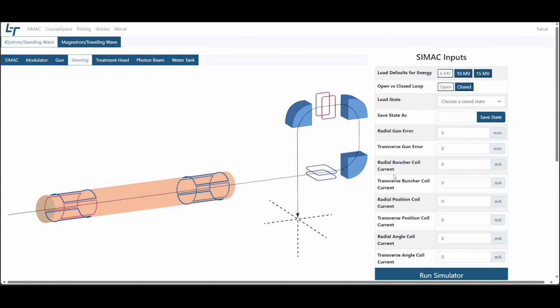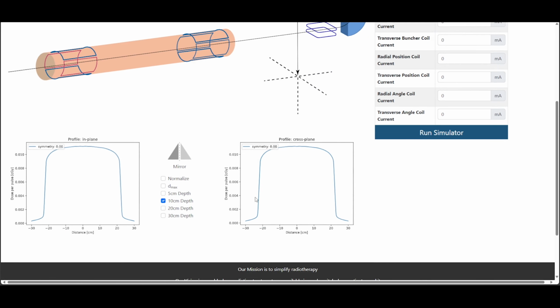Their corresponding controls are located in this table on the right. By changing the current flowing in the magnets, it is possible to adjust the magnetic field strength, which affects how the beam is deflected. Below you can see the in-plane and cross-plane dose profiles for a correctly steered beam. Generally, we would use a water tank scan to achieve these graphs. As you can see, the beams are symmetric, and Simac calculates the symmetry value to be 0.